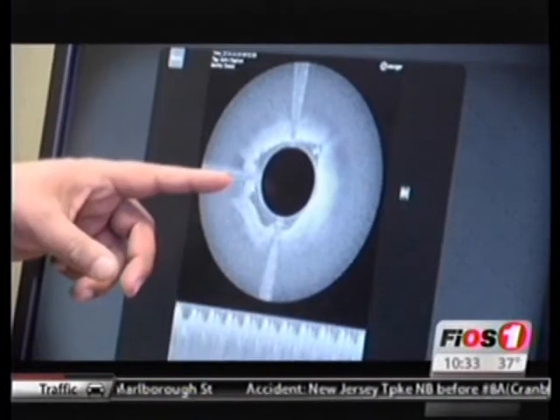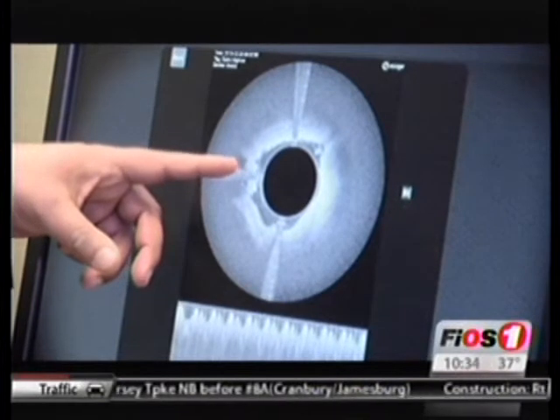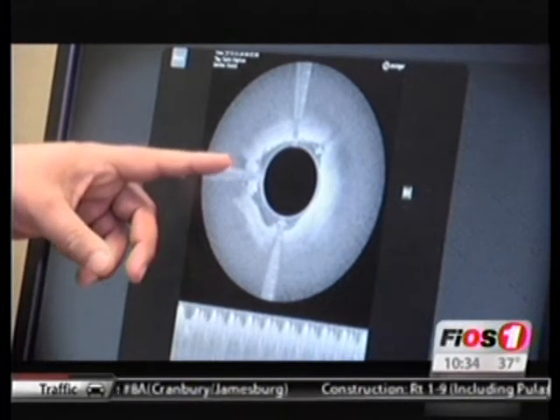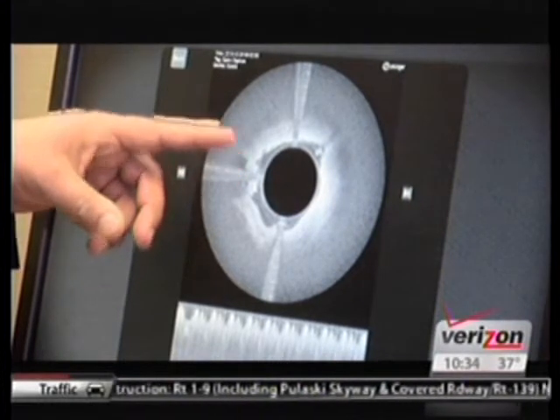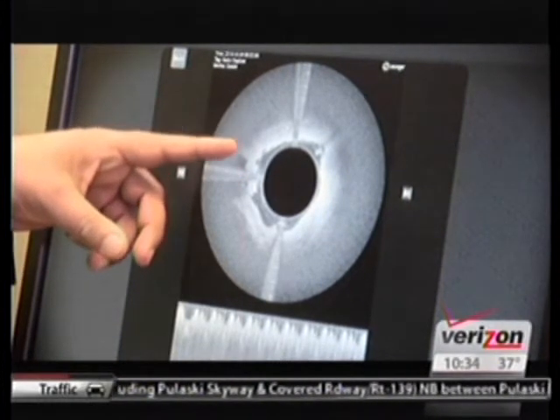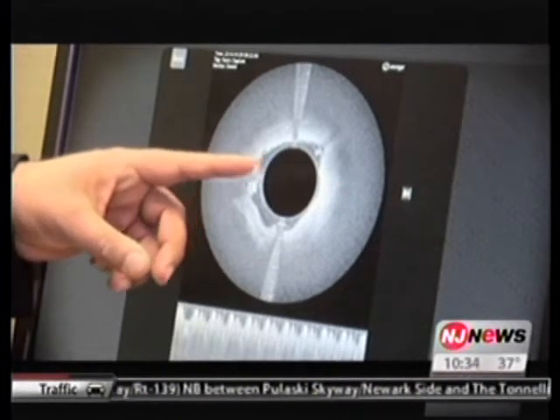So what we want to do is, the layers are the healthy areas. So this is the middle marker. So the catheter is deflected away from the middle marker. So we want to get the middle marker where the healthy area is. And then we want to advance towards the plaque, away from the healthy arteries.